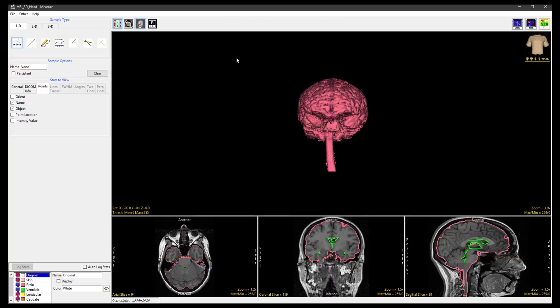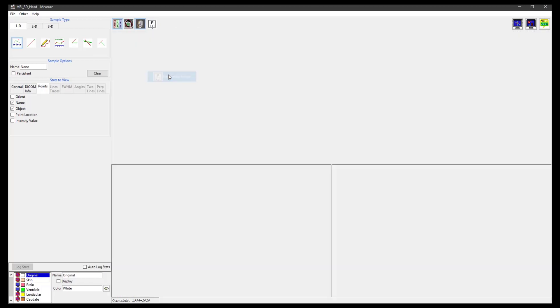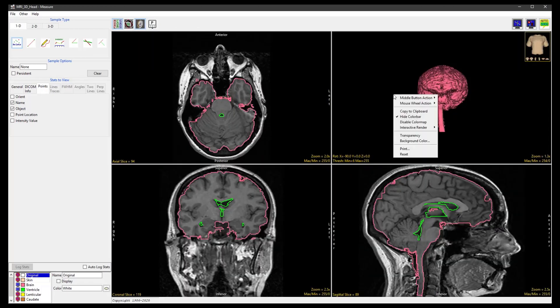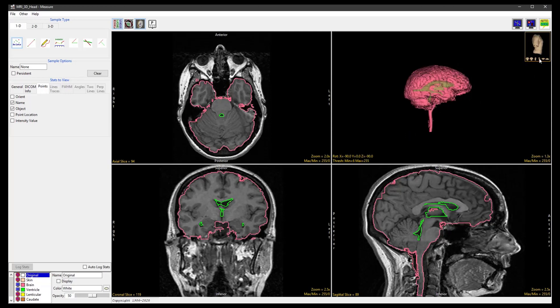In the display controls we will select no primary image so that all four panels are displayed equally. In the render window we can right click to select transparency, then click in the navigation panel to rotate the rendering by 90 degrees.